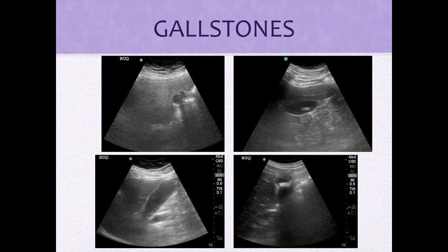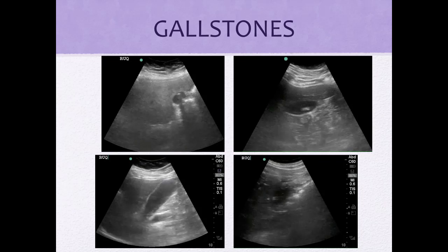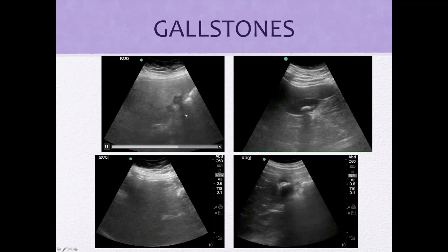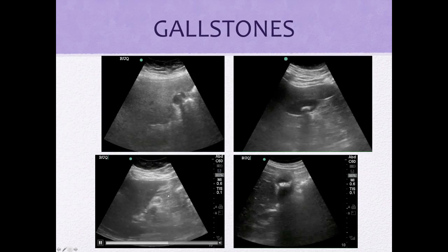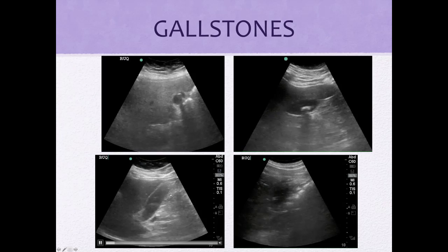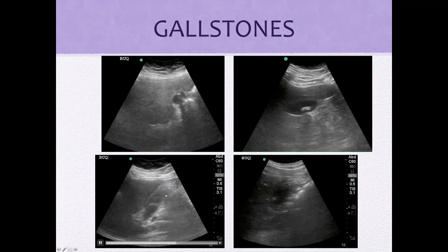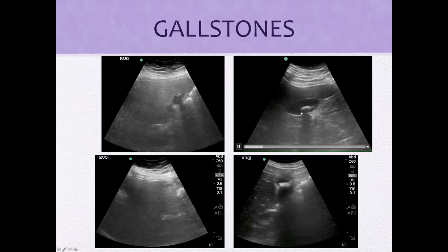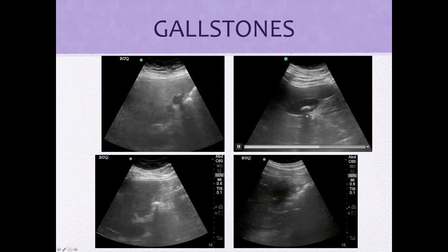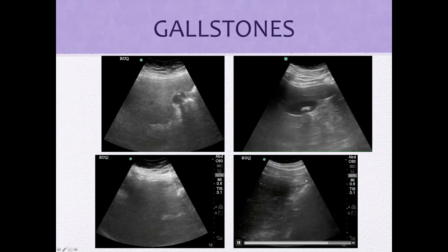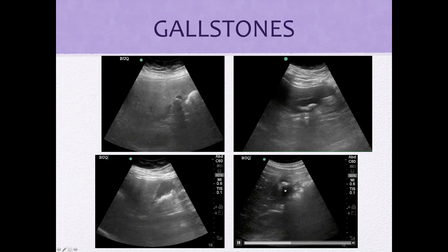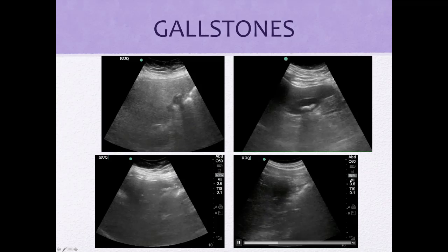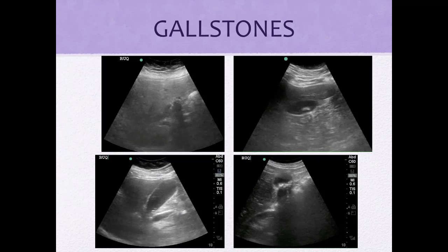Remember, gallstones create an acoustic shadow. Here are multiple gallstones — look at that nice shadow. Here, tiny tiny stones, lots of them, and at the end look at all that nice shadowing right there. A couple of big stones — shadow, shadow. This one has lots of stones again with acoustic shadowing. Remember, if we turn the patient to their left side we'd see these stones move around.